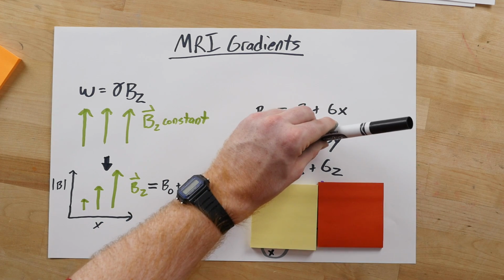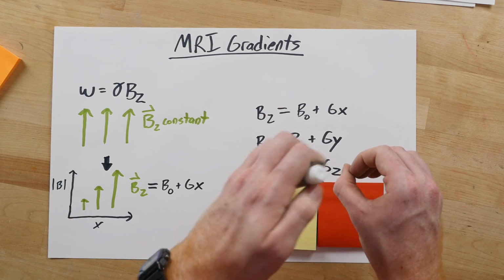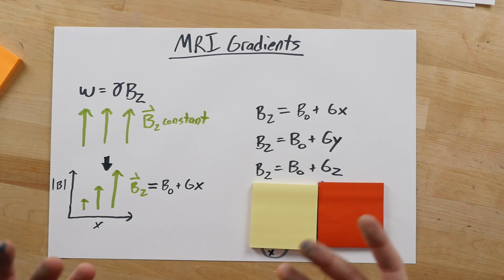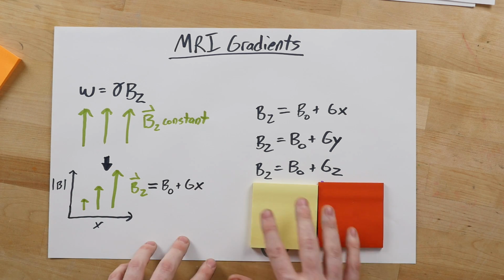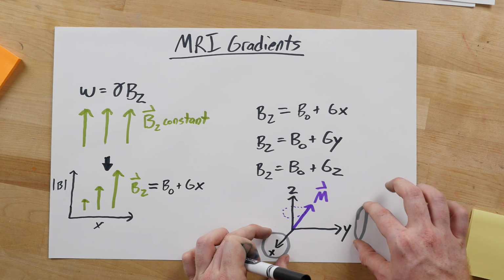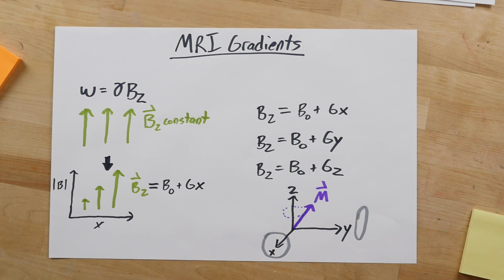So, if we have a dipole that has a magnetic field created, and we put a loop around it, we can describe the flux through it. Well, if we change that flux, according to Faraday's law, we therefore have a current. So that current in the wire that we've just put there actually picks up on how the magnetization vector changes. So, as M spins around, if I place some loops nearby, I can calculate the flux through that by collecting some currents, which we can measure, and resolve all of this back into an image that doctors and other professionals can look at.